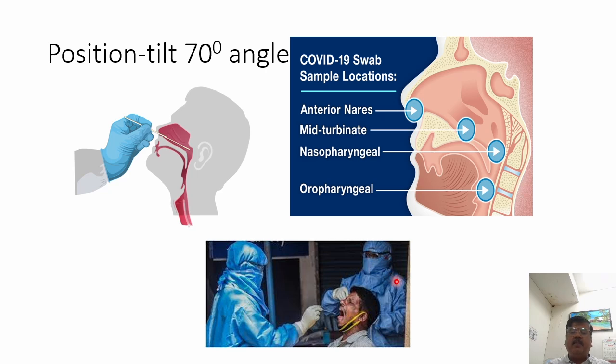So you can see the photograph. A little bit of tilting of the head is necessary to visualize. And suppose you are taking an oropharyngeal sample, a tongue depressor is necessary because the tongue will come in between. So a tongue depressor is necessary as an additional requirement for sample collection. There may be a gag reflex or the patient may feel uncomfortable during collection, even with nasopharyngeal, because we are penetrating 5 to 6 centimeters inside the nose.